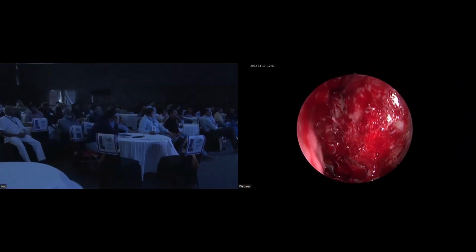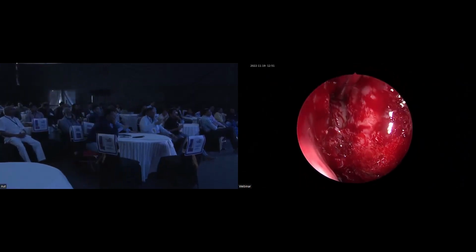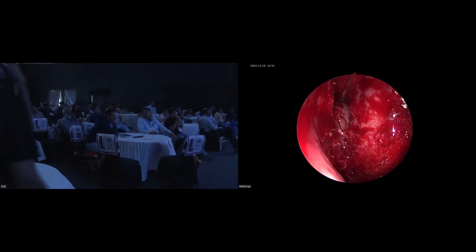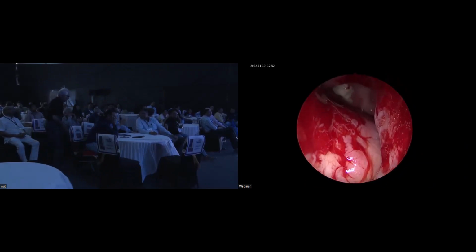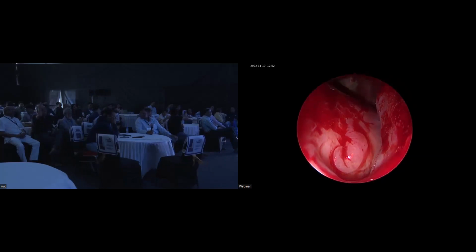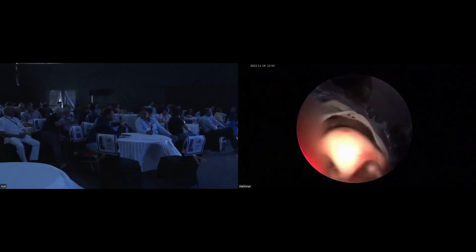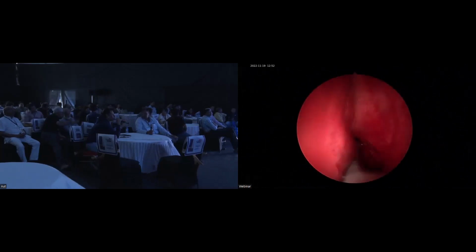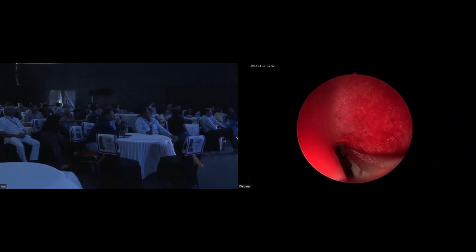Frontal forcep आहे का? Madam, malleable suction नाही त्यांच्याकडे. Malleable suction. It is falling short there. If I had a 90-degree suction also, no, it will come. But I don't have a 90-degree suction here. It will flush it and come.